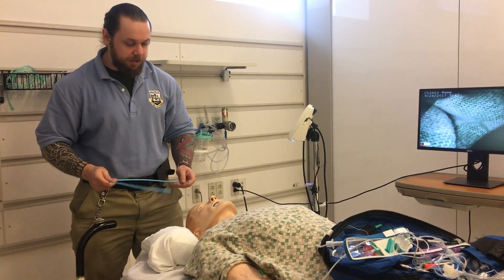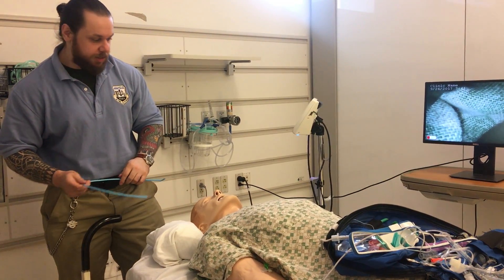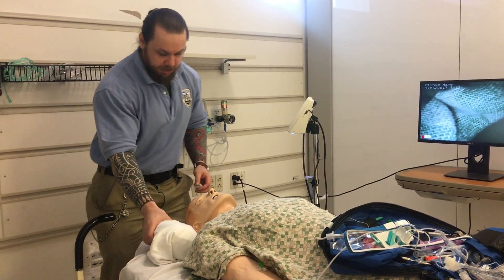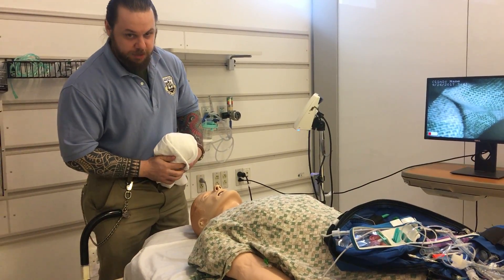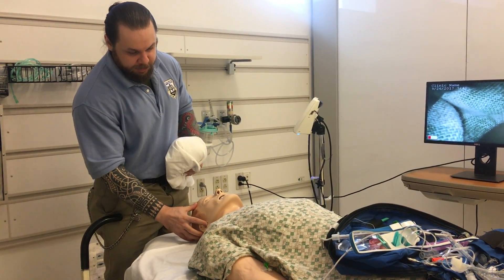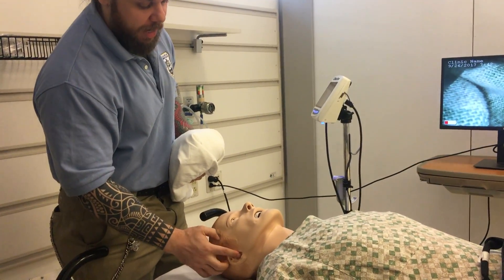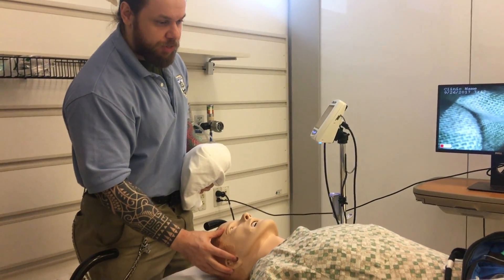The first thing I want to talk about is positioning. The important thing is you want to align the auditory meatus — that's the ear hole — with the sternal notch, and that will facilitate an optimal view when you're trying to intubate.